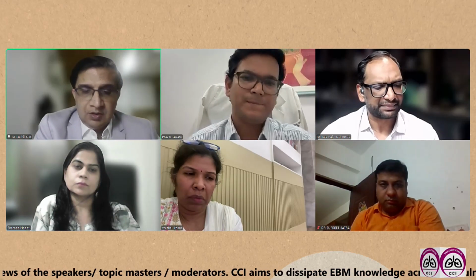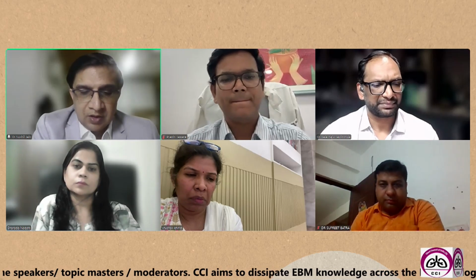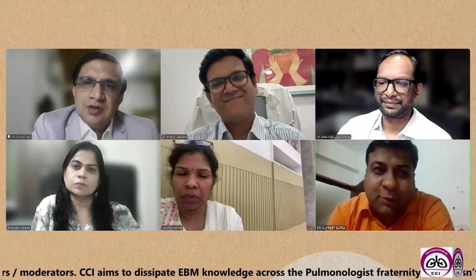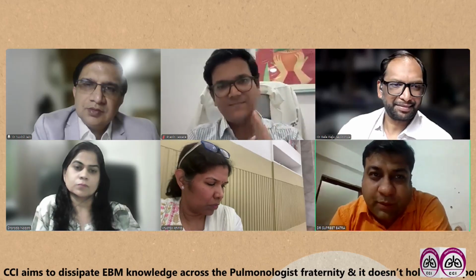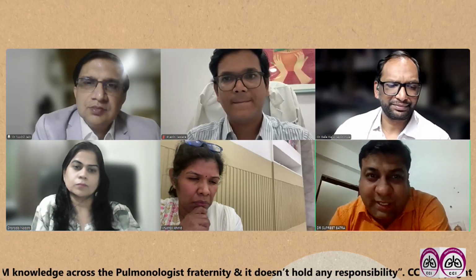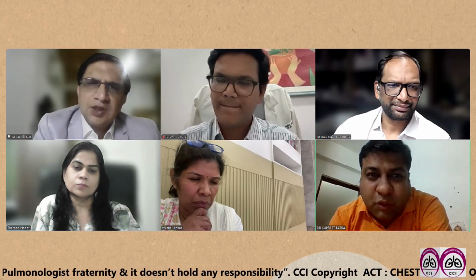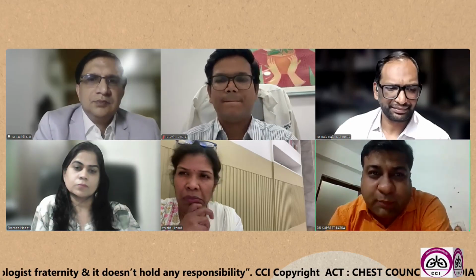Yes. My next question is to Dr. Supreet. Dr. Supreet, how do you manage bleeding during EBUS TBNA? Yes, sir. So before doing a pass, we usually use a Doppler to see whether there's a vessel in the lymph node or not. If there's a big vessel, we usually avoid targeting that vessel. But we have seen the bleed during EBUS is usually very minimal. It usually stops by itself, so need not worry about the small bleeds.